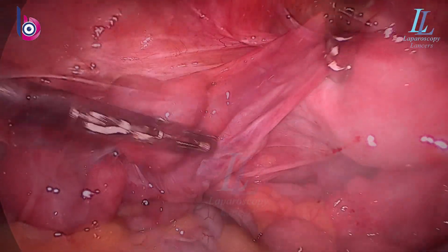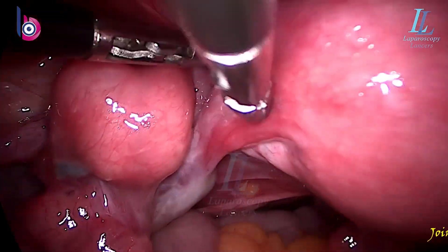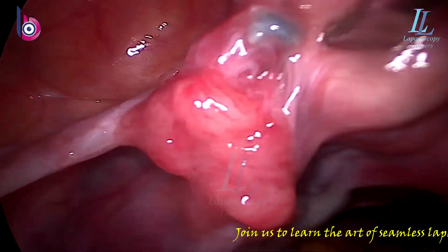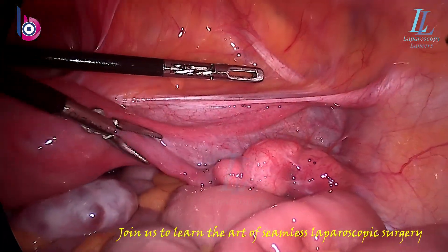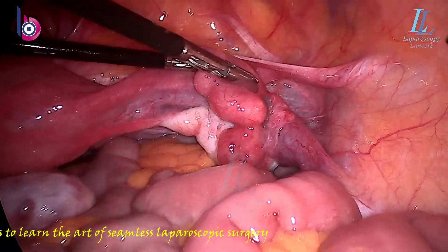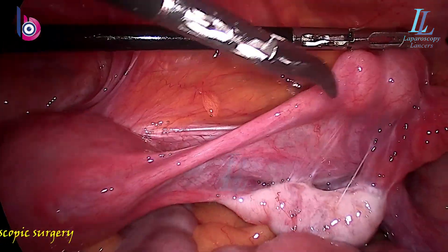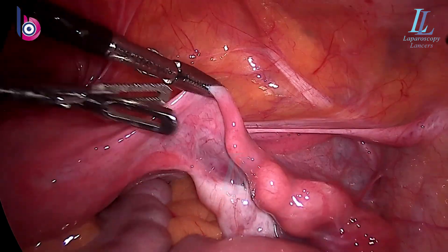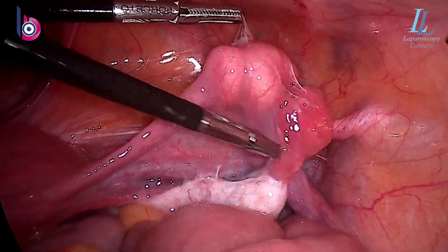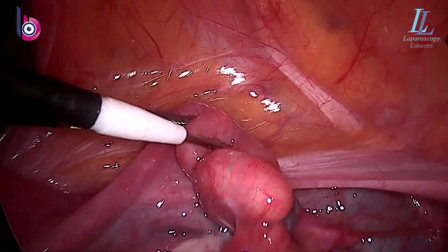We had no idea we would encounter such findings inside. You can see the beaded tube on the left, the normal isthmus of the fallopian tube, and sutures near the fimbrial end. Similarly on the right side, the beaded tube laterally near the fimbria — something near the fimbria. The tubectomy part appears normal. This is how and where the tubectomy should have been done. HSG showed bilateral tubal blockade.